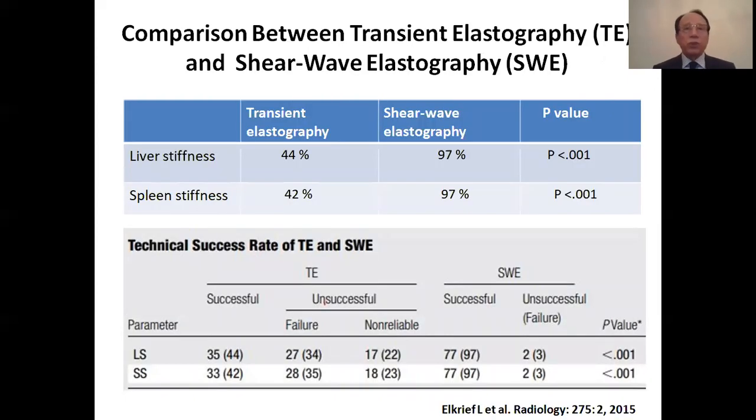Acoustic radiation force impulse elastography with any B-mode liver ultrasound scan gives detailed and reliable information on the severity of liver fibrosis. The mean shear wave velocity measurements in the liver and the spleen demonstrated a good correlation with the portal vein pressure measured with hepatic venous pressure gradient. However, spleen elastography is inferior to liver elastography for the detection of portal hypertension.